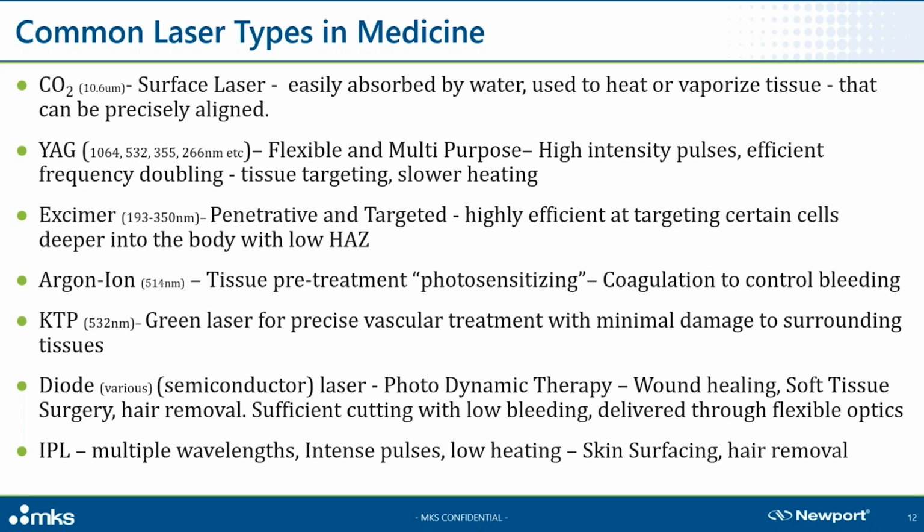The YAG, or ND-YAG, is the most pervasive, most studied, and most implemented laser in history. This is your do-it-all laser. Optically pumped, like the first ruby laser, the neodymium rod is specifically doped with various materials. It produces high-intensity pulses and efficiently frequency doubles, allowing for wavelengths at 1064, 532, 355, 266, and more. YAG lasers are used in many medical applications, such as endoscopy, urology, neurosurgery, gynecology, and dermatology.